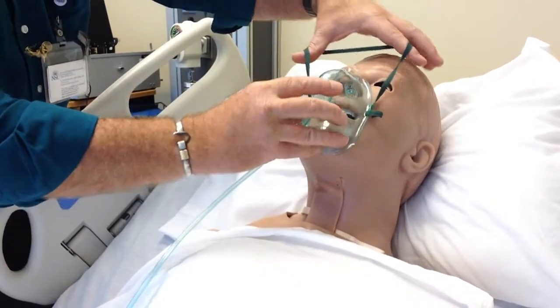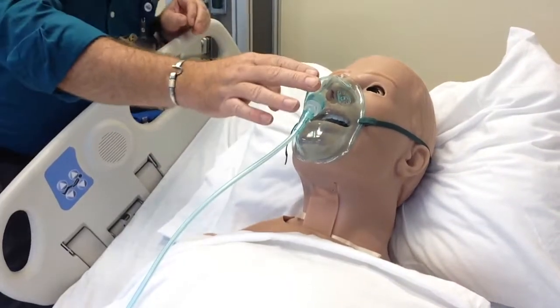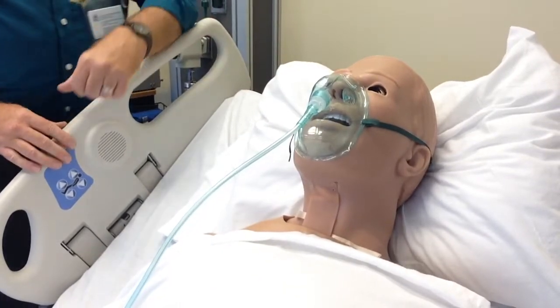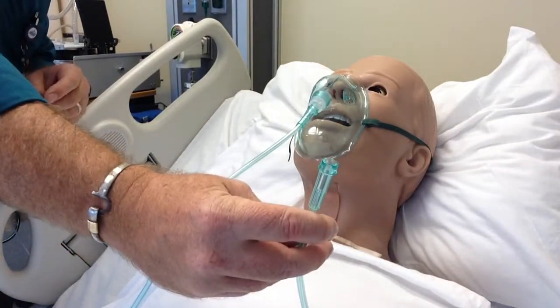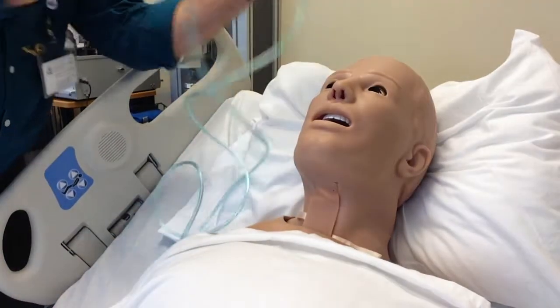...because this will go over the chin, over the nose, and then the strap goes around the head. As the patient breathes out, carbon dioxide collects in here. If you don't have the adequate flow, you will not flush out the carbon dioxide. This connects to the wall as normal.